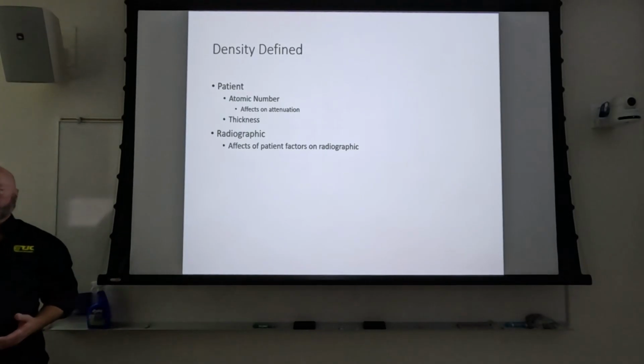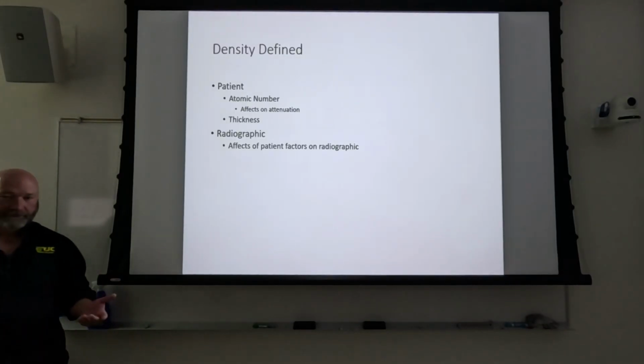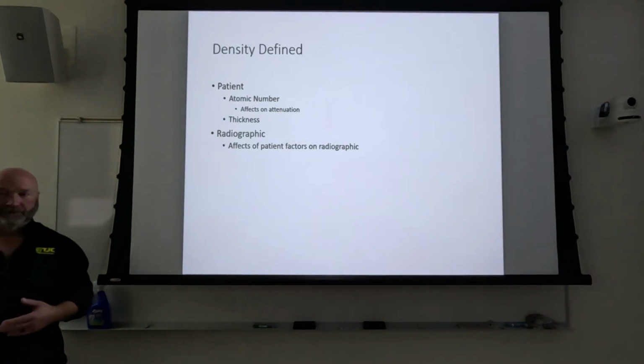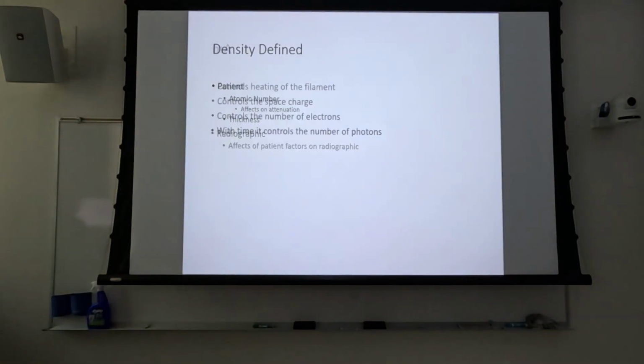So, back to the KUB example, if you were to shoot an image where you grossly underestimated the mAs value that you should have, then naturally your image receptor exposure is going to decrease. Probably more than seeing a decrease in the actual density on the image receptor, you're going to definitely see your index number change to reflect that underexposure, but you potentially could introduce some quantum mottle there. So radiographic density is just the darkness of the image.